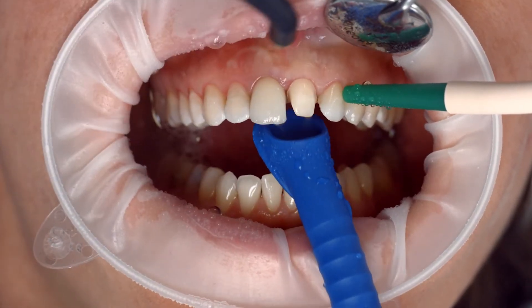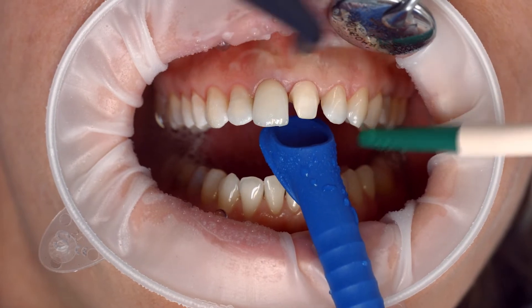Thoroughly rinse off the Try-In Paste with water spray after try-in and dry the preparation with water and oil-free air.